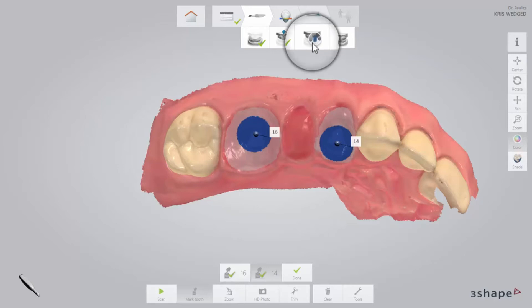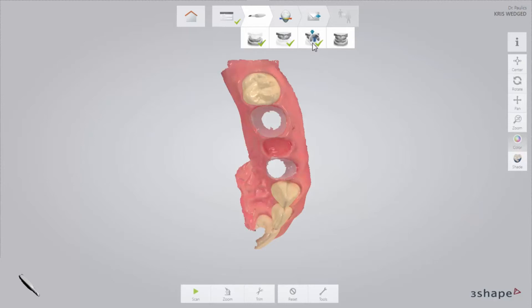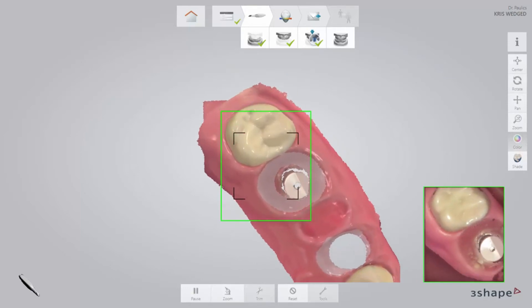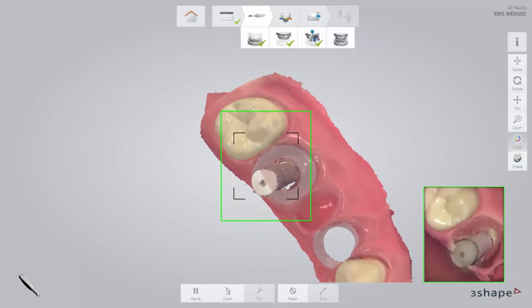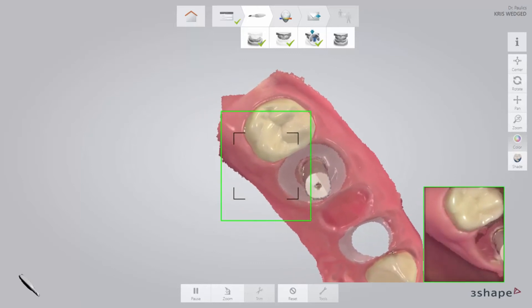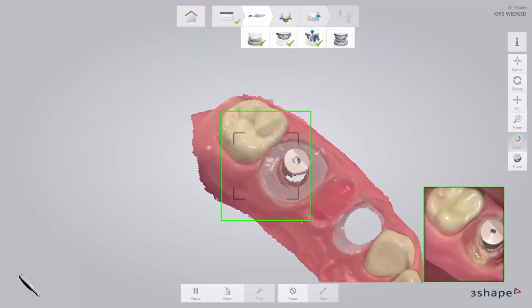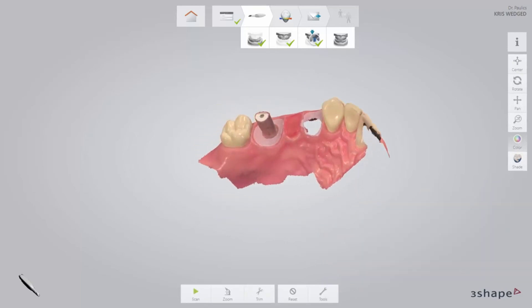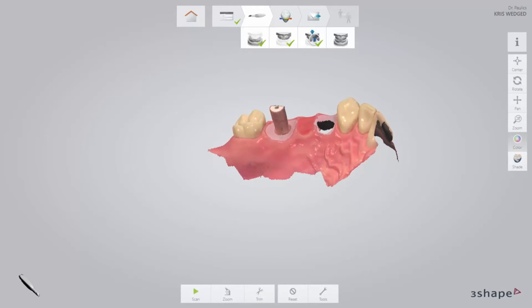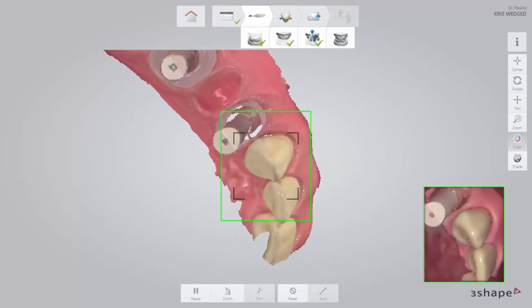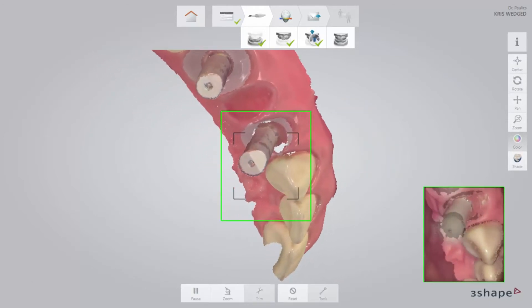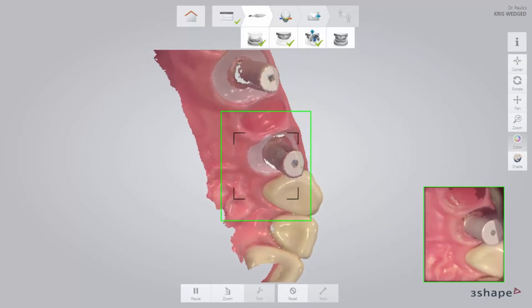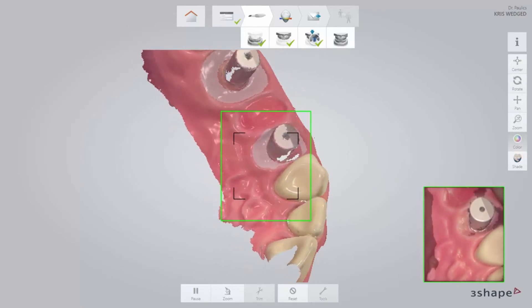Now proceed to the scan body page in the top workflow bar. First, make sure that all of the healing caps have been trimmed away, as well as the nearby surrounding area. Insert the scan bodies and start the scanner pointing at a neighbouring tooth. Once the scanner has picked up the position, slowly move to the scan body and circle around it to scan from all angles. It is especially important to cover the upper third of the scan body to make sure it is possible for the laboratory to recognise the correct position. If you have only one scan body, you may move it between the implants to scan them one by one.